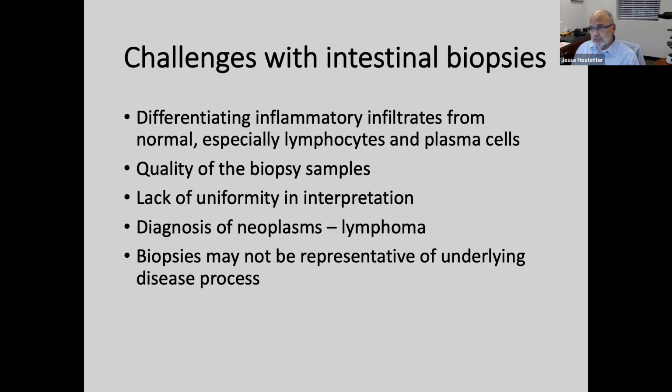We're also at the mercy of the person who's taking these biopsies. If it's a surgical biopsy and it's full thickness, usually those are pretty good. Endoscopic biopsies are tricky. And I'm here to tell you, if I had to take an endoscopic biopsy, they would be horrible.